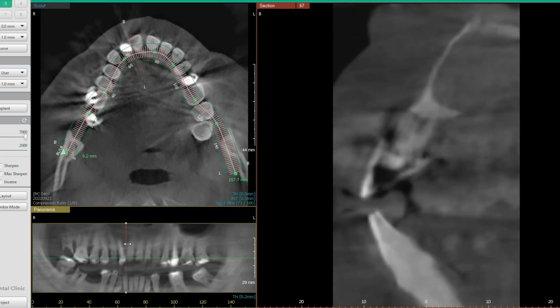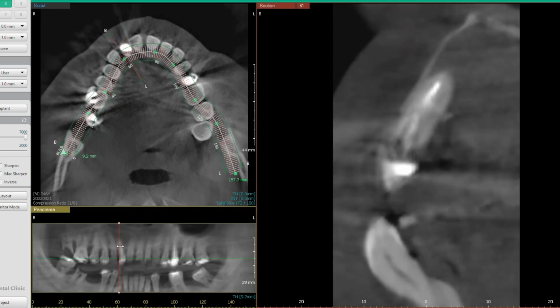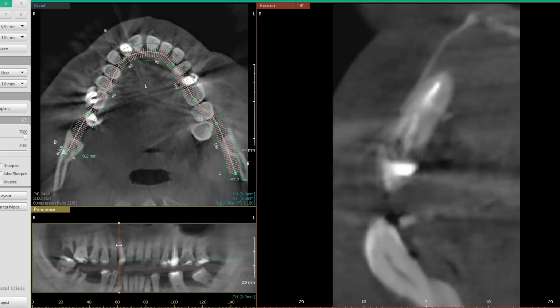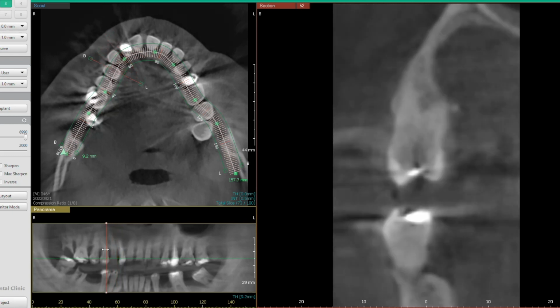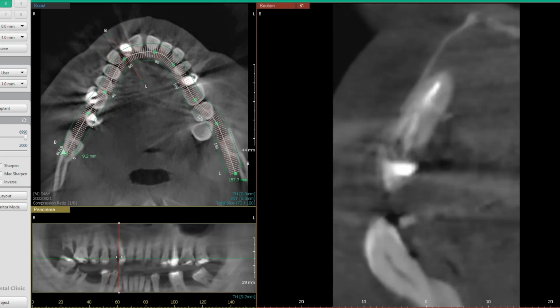So this is basically the beginning of the infection. So all the bone that used to be there for the other side, now that's all gone, eaten away by the infection. All right, so see all that bone loss. And what was the culprit? It was this tooth. This tooth with the failed root canal is what created that huge chronic infection. And this patient then resulted in a large cyst. And what that cyst does is it destroys all the bone that was there. So that's basically what happened with this patient.